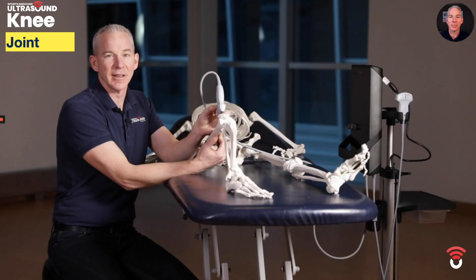Time for the knee joint. I'm going to show you how to scan the suprapatellar recess of the knee joint.